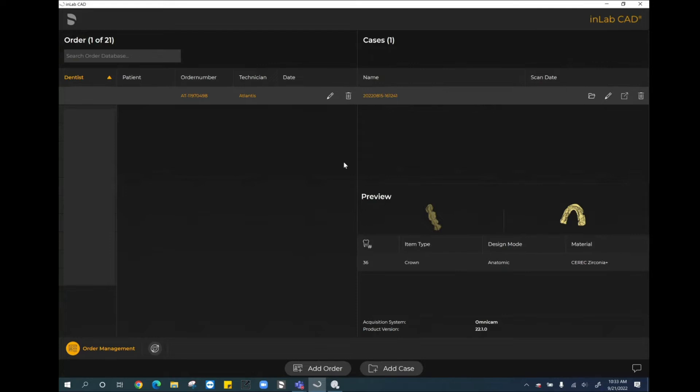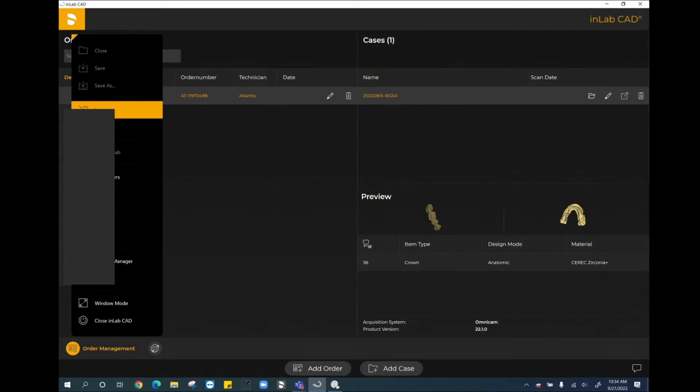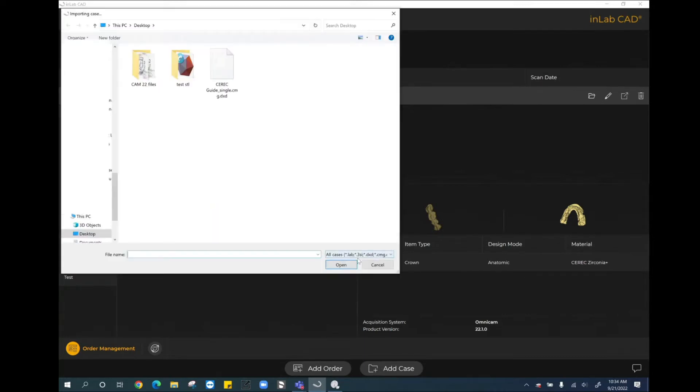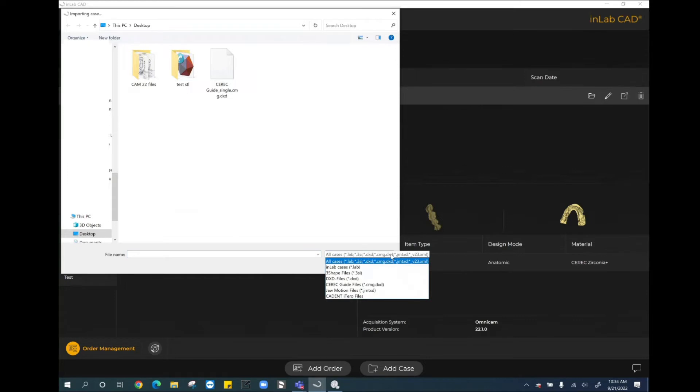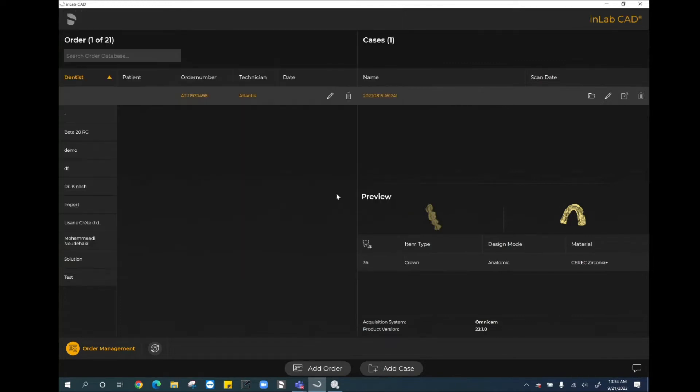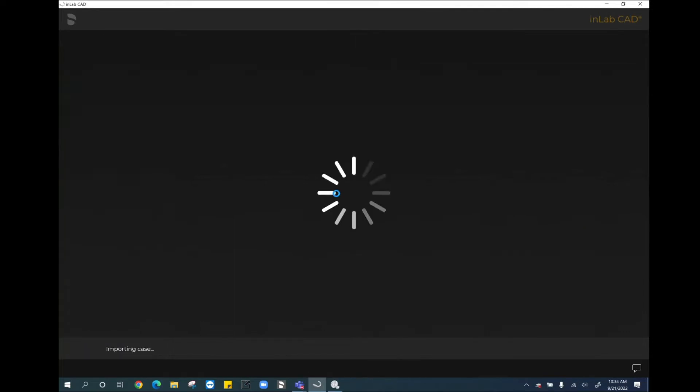When you're in the InLab 22 file, you will notice that you're in the order management window. You can tell because it's highlighted here on the bottom left hand side of the screen. If I want to now import the CMG.DXD file, because it already has part of the DXD attached to it - the scan of the patient from the intraoral scanner - we already have a lot of data for the patient name and things like that. So we don't have to add a new case here or add a new order. We actually come up to the DS logo, select import. When you select import, you can see under the different type of files, one is noted as CMG.DXD. I'm going to select that file and select open. So now it's going to import this implant planning file into my software.